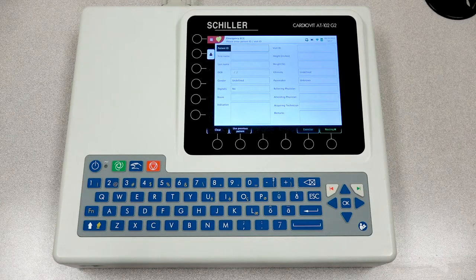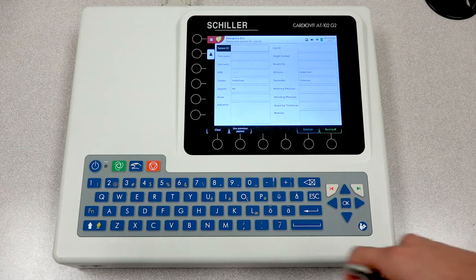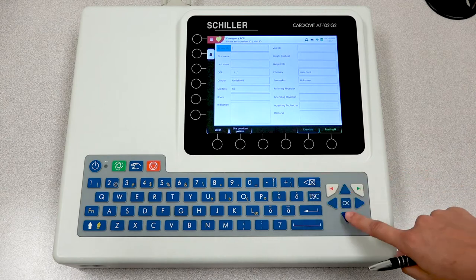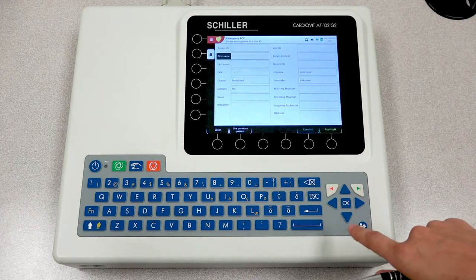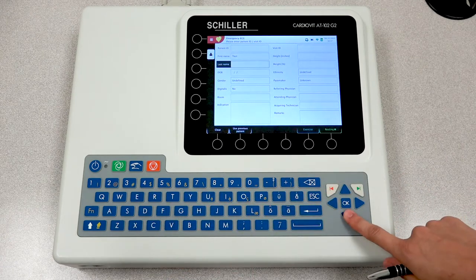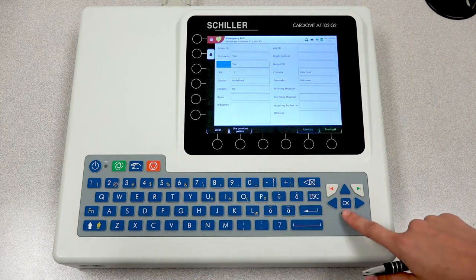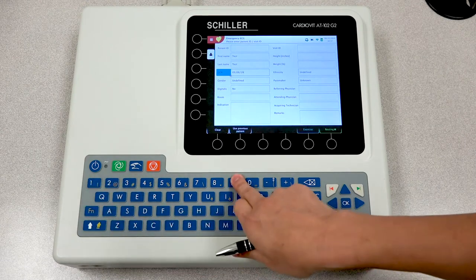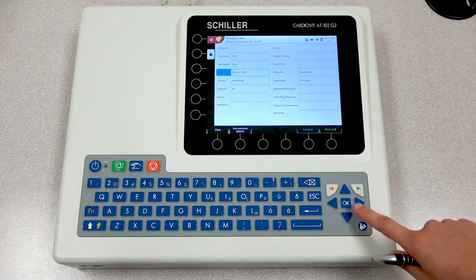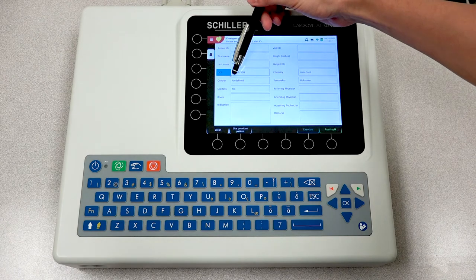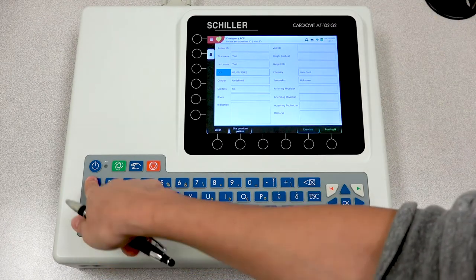Upon power up, the unit will automatically go into your patient data screen. You can begin by entering the patient ID, or choose to leave it blank. Please note that if left blank, the unit will automatically generate a random patient ID. The next field is your patient's first name, followed by the last name and date of birth. The format of the date of birth is very important, so please ensure that you enter it correctly. If entered incorrectly, there will be a little red X indicating something is wrong, so please be sure to correct it before moving forward.